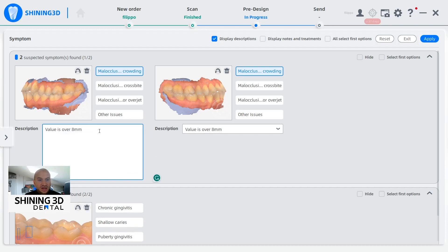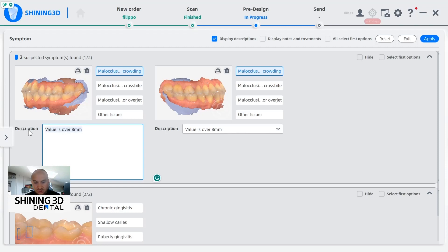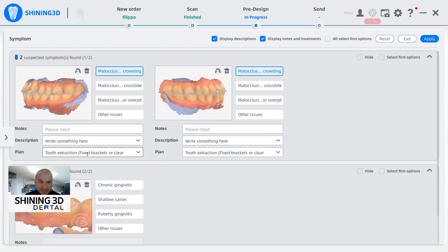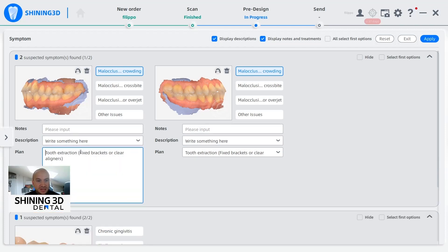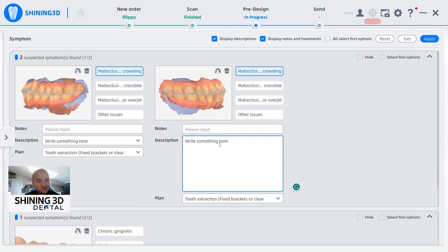We can also write some notes. Automatically, the artificial intelligence has already done a great job — for example, in this case the description value is over eight millimeters. But if the doctor wants to write something, it's possible to add any kind of note. We can also add more details such as the description or the plan, making it possible to write a super detailed report that at the end of the medical visit the doctor can share with the patient.